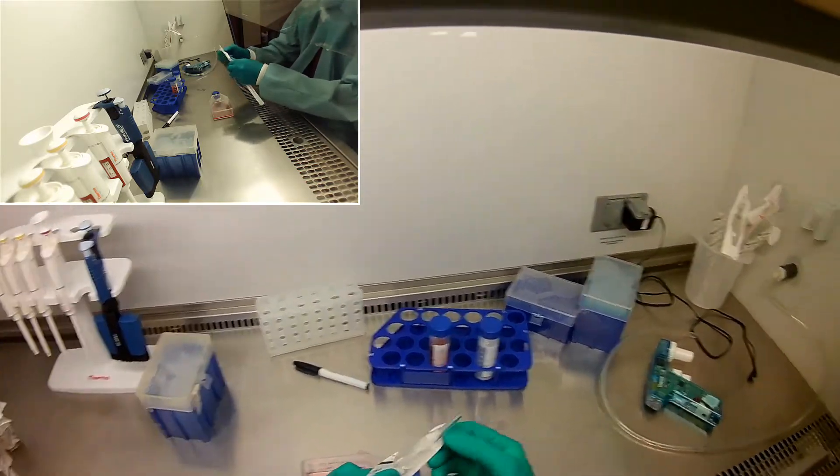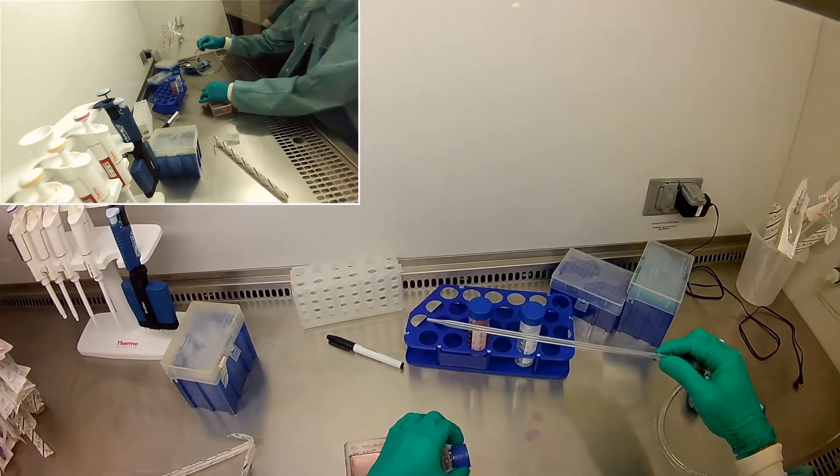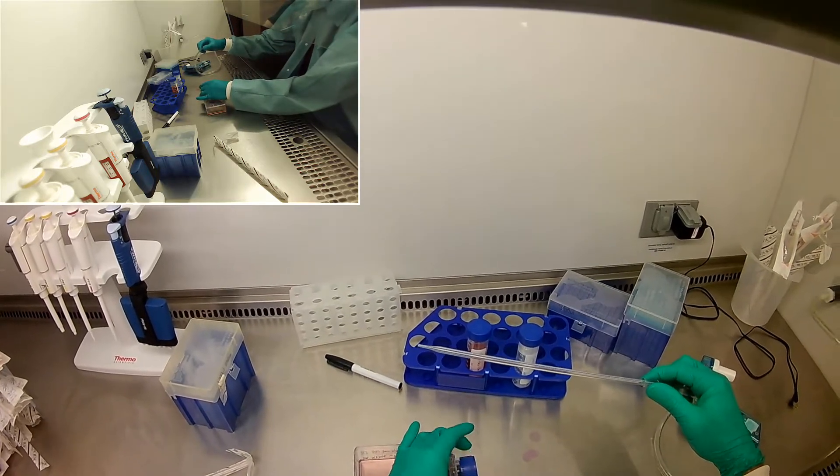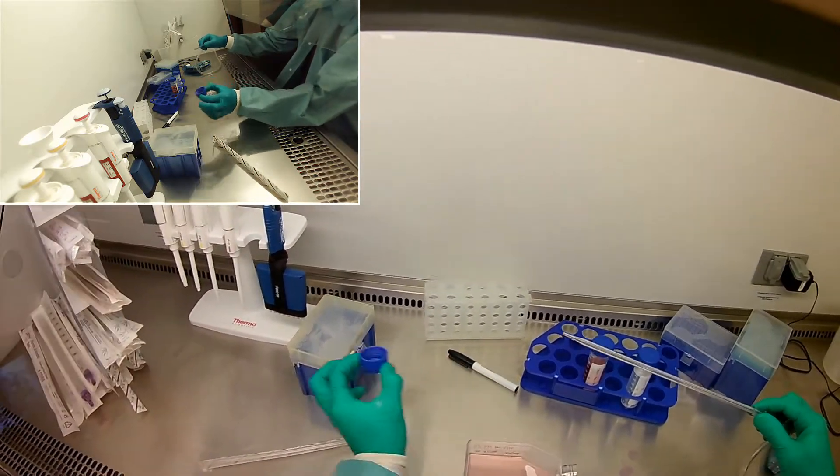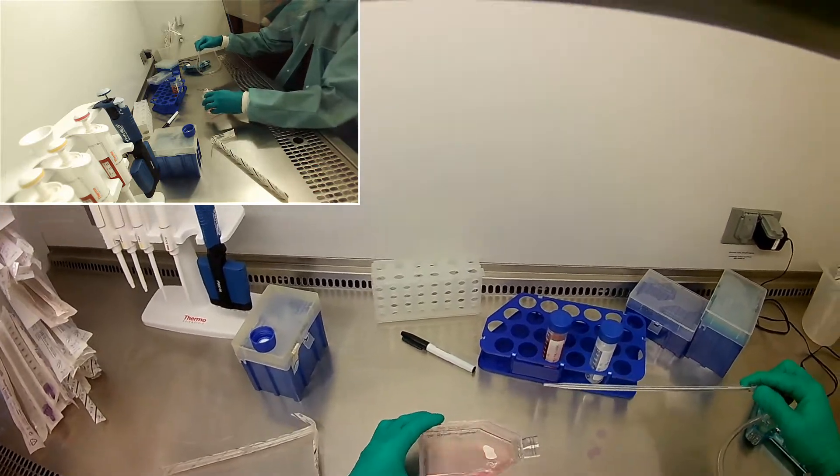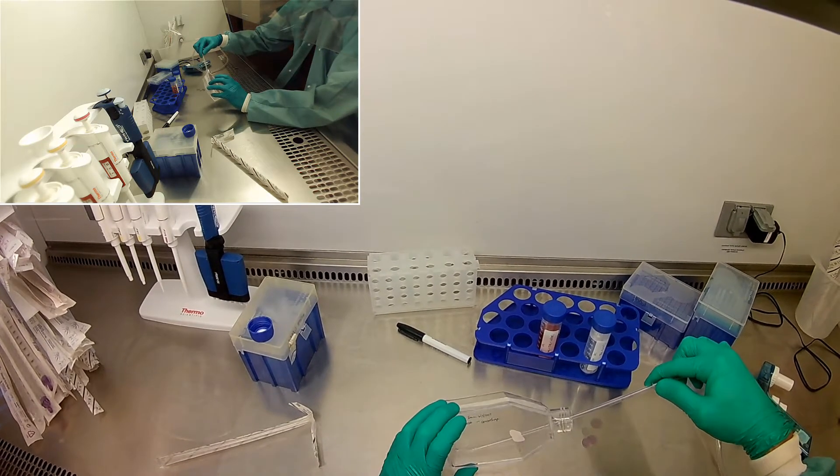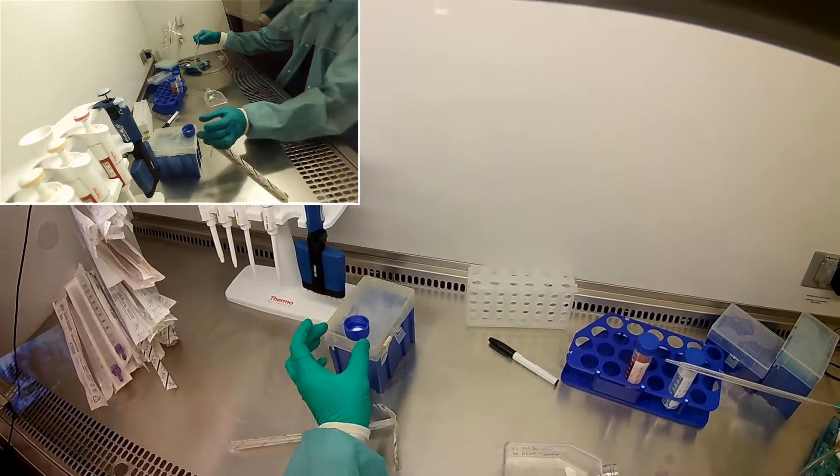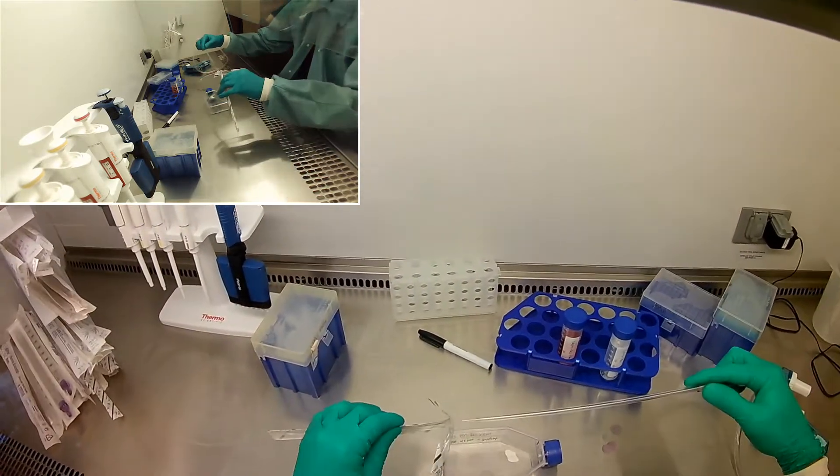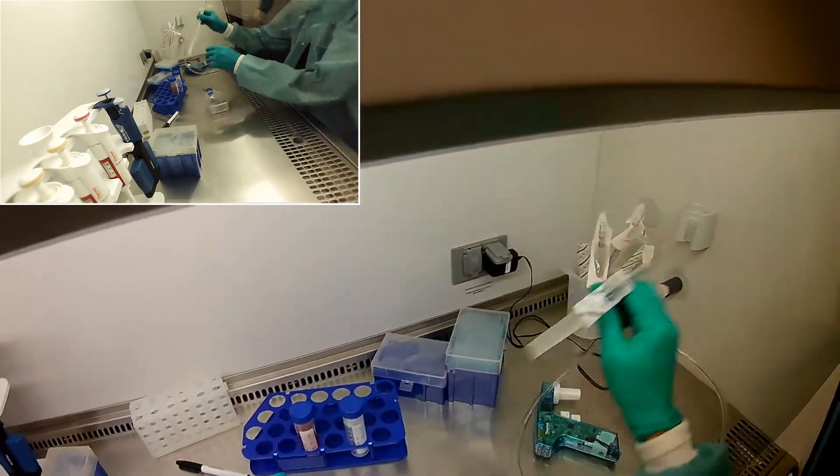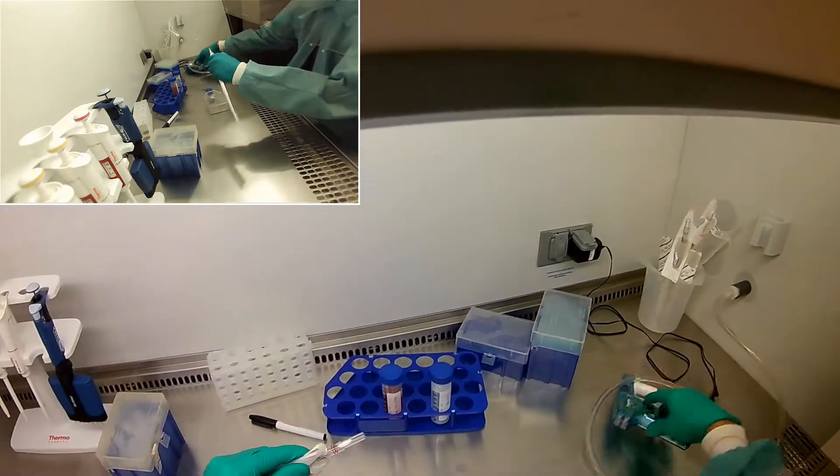So first thing I'm going to do is aspirate out the media. I'm going to be very careful with the cap, right? I don't want to put my hand over the cap or the opening. So I'm going to be very careful about flipping this over, making sure that it stays open to air. And I'll just leave it off to the side, open to the sterile air on top. All right, I'm going to suck out all that media, very careful not to go over the cap but to come from the side.